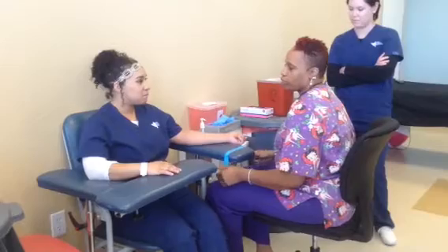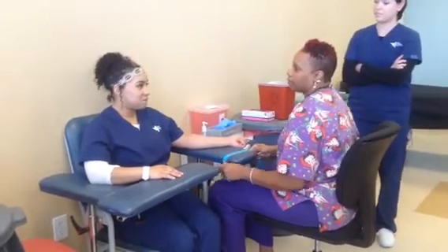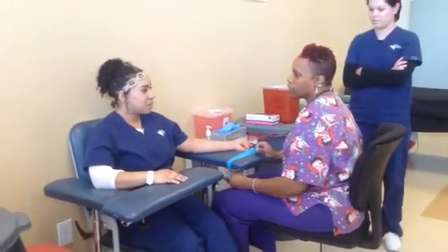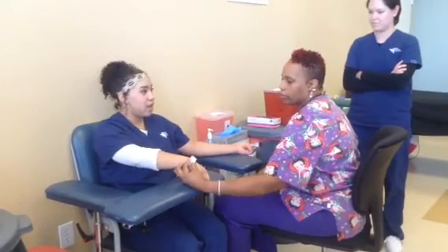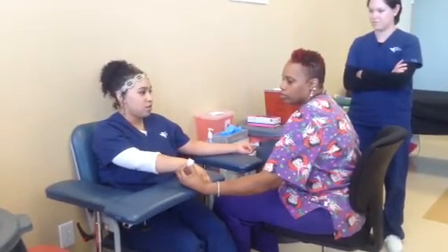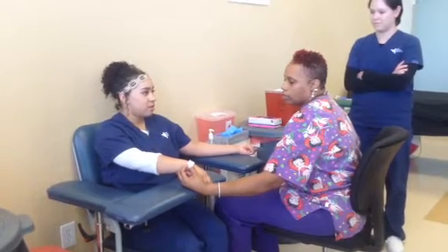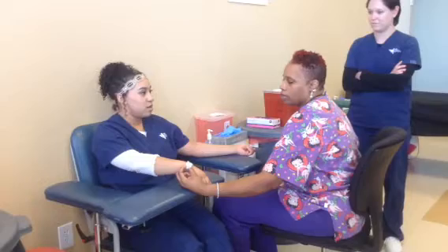The first thing you want to do is introduce yourself to your patient. Hi, my name is LaShawn. I'm from the lab. I'm going to be drawing a test from you today. Can you please tell me your name? I'm Monique Luna. Can you spell that for me, please? M-O-N-I-Q-E-L-U-N-A. And your ID number? 0421.